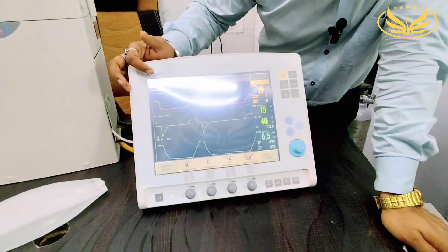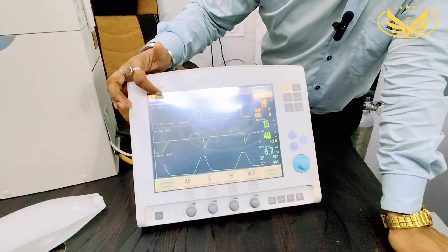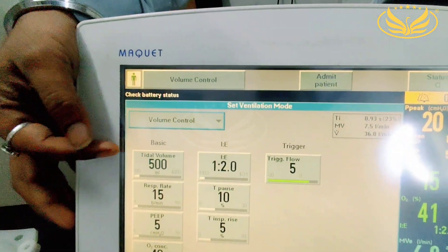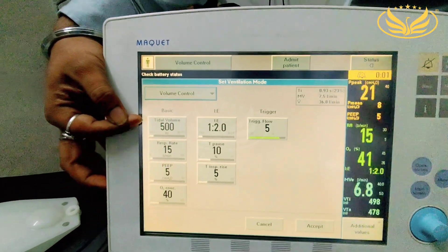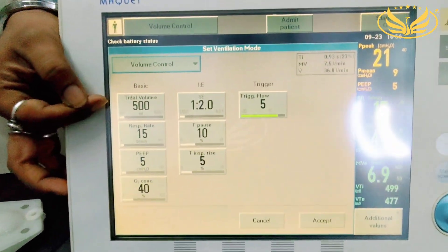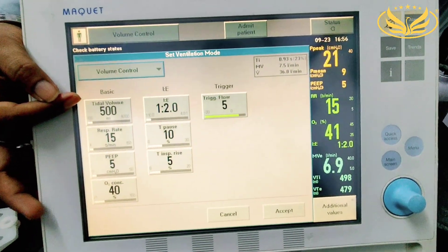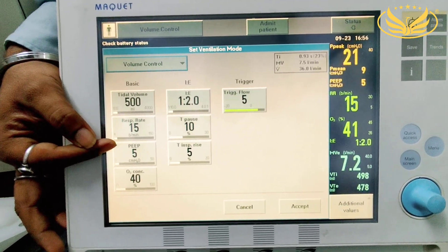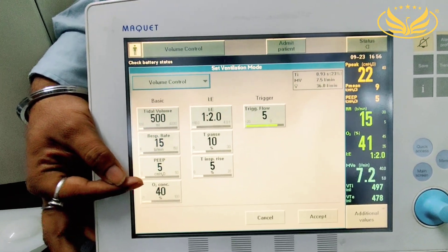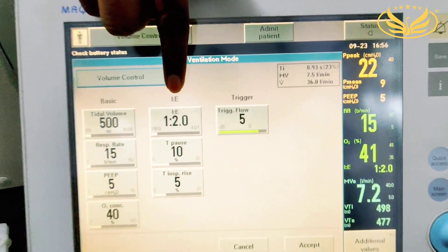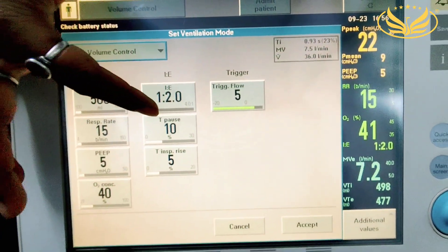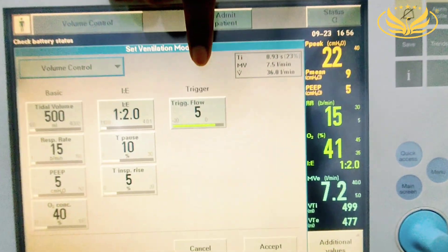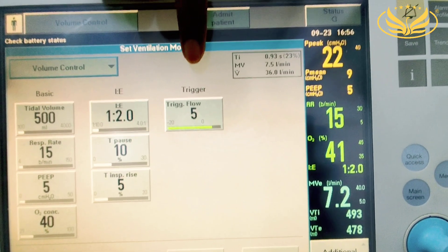We have kept this in volume control mode. In volume control we can see certain parameters which we have to set as per the requirement of the patient, as decided by the doctor. In this case, tidal volume is 500 ml, respiratory rate is 15, PEEP is 5, FiO2 is 40%, IE ratio is 1:2 (inspiratory to expiratory), T pause is 10, T inspiration rise is 5, and trigger flow is one of the important parameters.